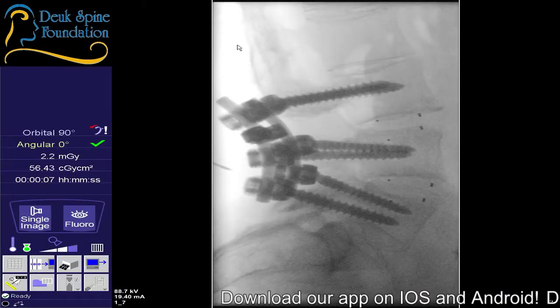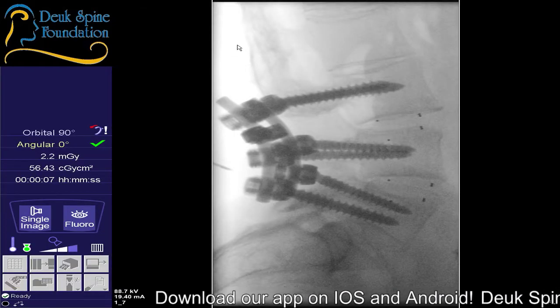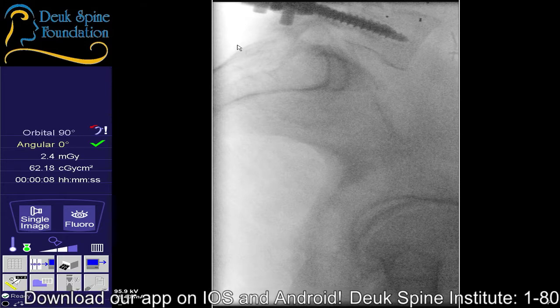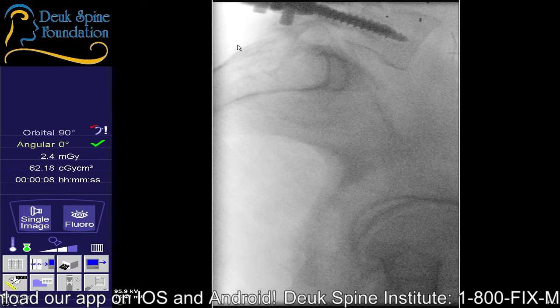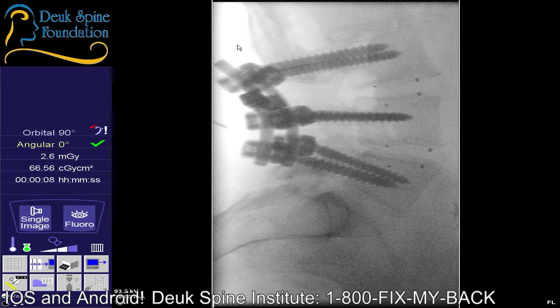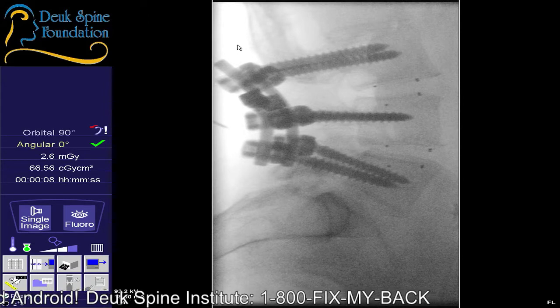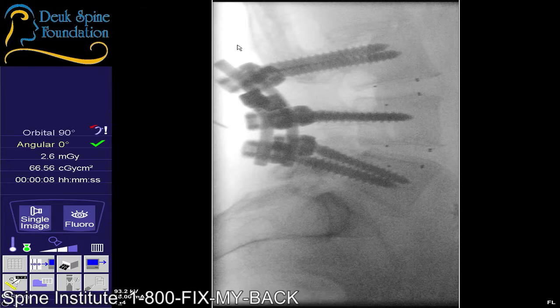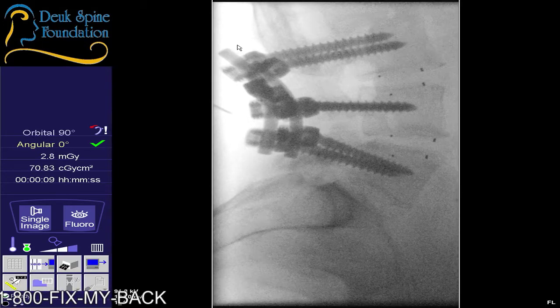I think it's worse. So we're looking at the L5 end plate. That's the bone. Yeah, that's better. Let's move the whole fluoro north. We got a little too much hip. So one of the first things we have to do is get the x-ray machine positioned better. I think you need to go further north with the base and then wag my side south. All right, that's better, but it's still not where I want it. So let's try releasing the wag and let me control it.